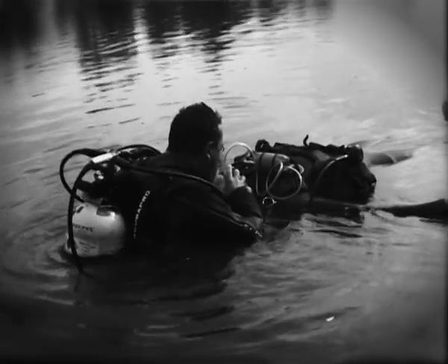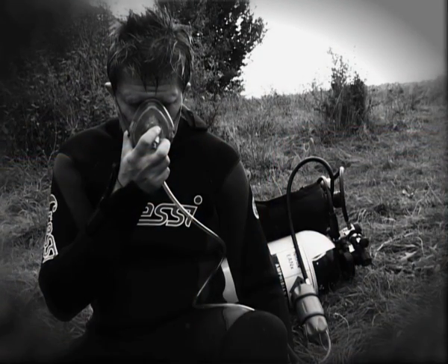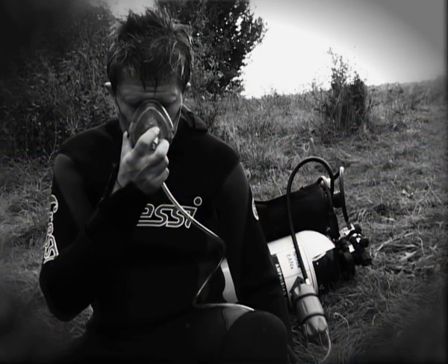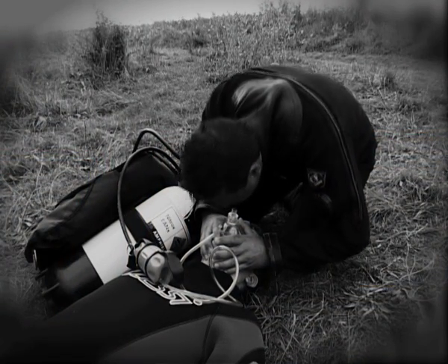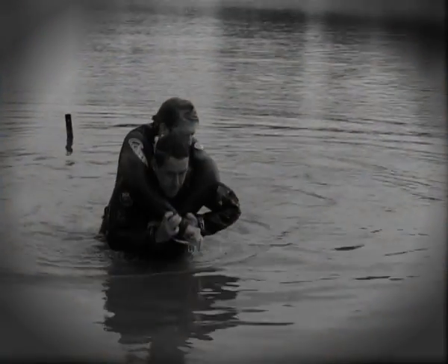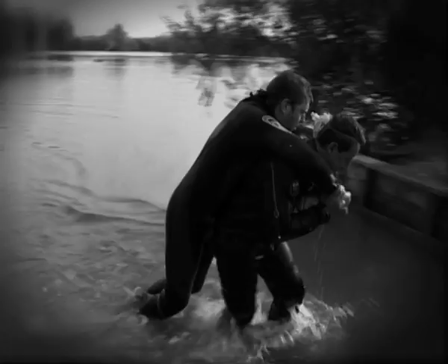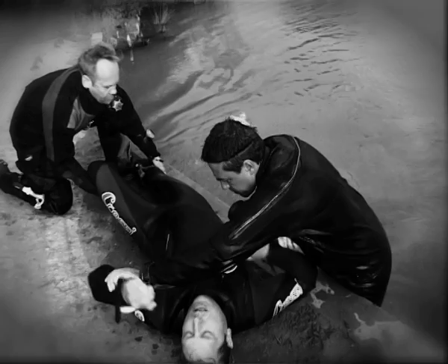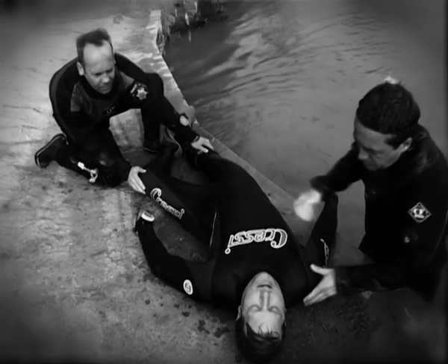Most rescue diver certifying associations state that if you run out of oxygen but have enriched air nitrox available, you can give that to a responsive patient via a scuba regulator. But what if a rescue diver using nitrox was involved in a rescue where the patient may be unconscious or semi-conscious, on a private rib or boat where an O2 kit is not available? How can the rescue diver put his nitrox to good use in this situation?